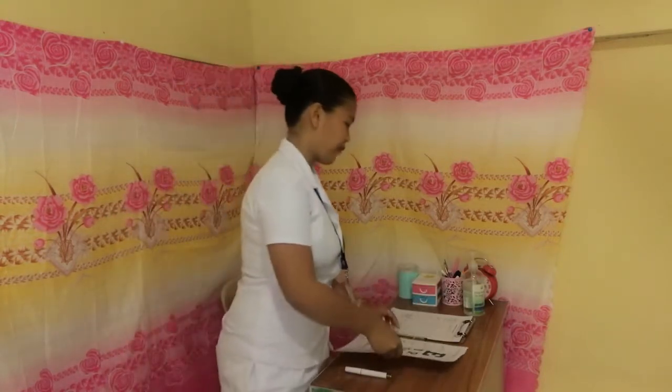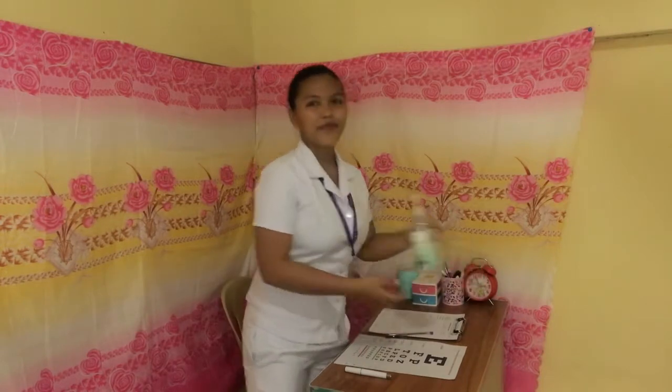To start off, we need to prepare all the necessary equipment that we're going to use. So, we need a pen light to have a better visualization, the Snellen chart. You could also use an E-chart, a pen, and the comprehensive health form where we are going to write all the subjective and objective data that will be gathered, alcohol to sanitize our hands, and also gloves if necessary.